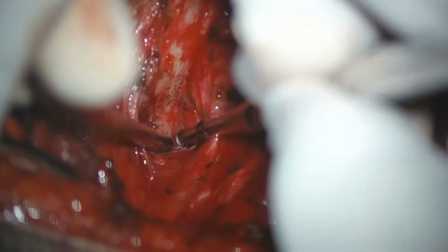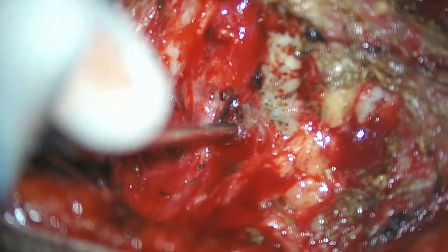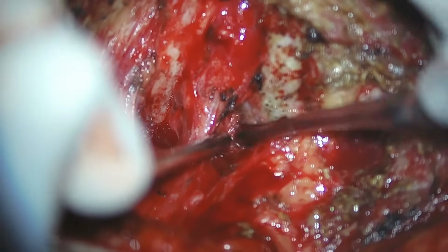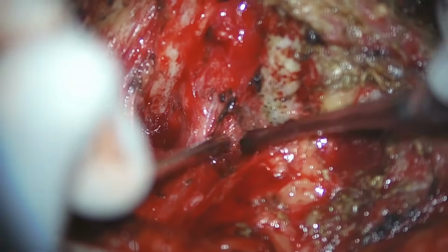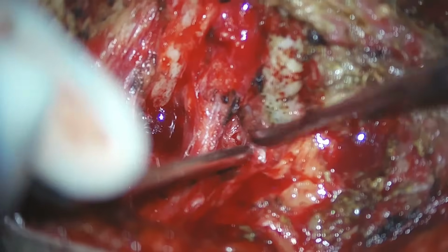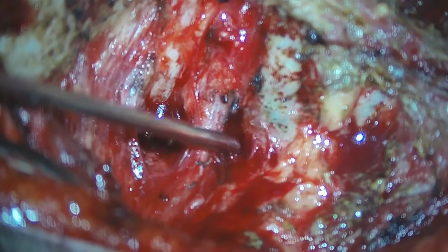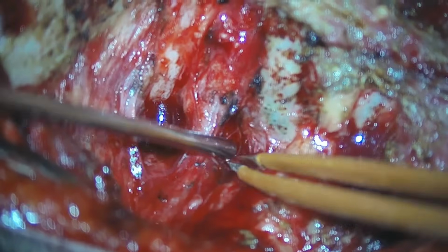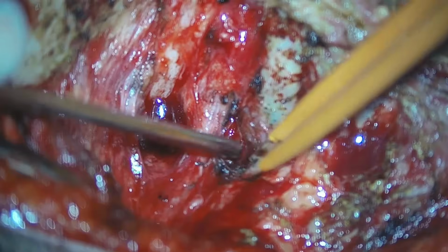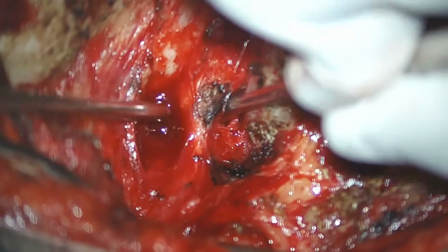Later, we also separate the adhesions over the C2 lamina and the C2, we will expose the C2 pedicle. Here we can see the articular junction between the C1 and C2.